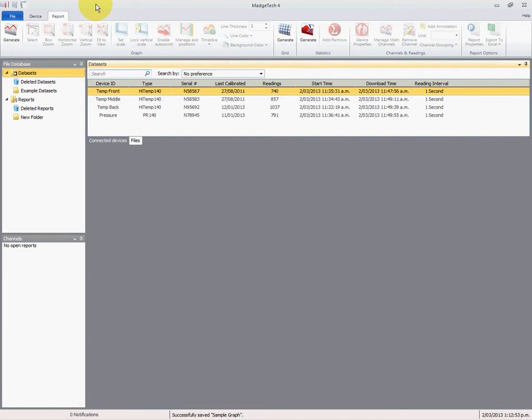We've got Magitech open and we've got four data sets that we've recorded from one sterilization cycle: three temperatures and one pressure.